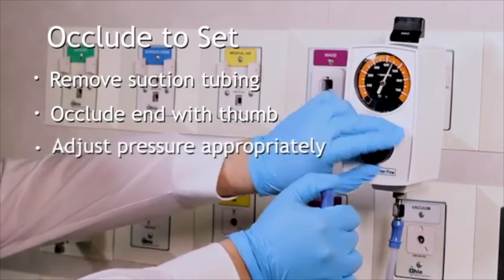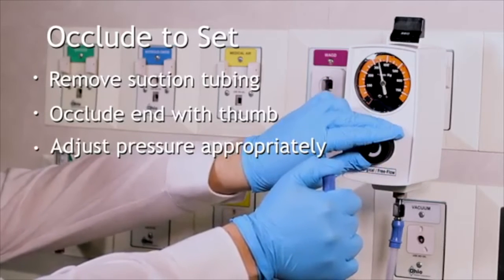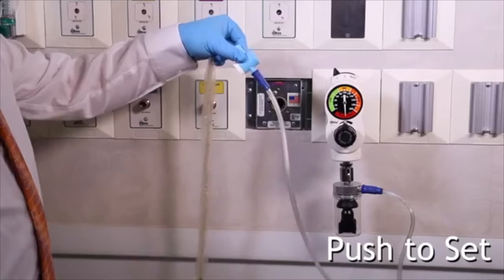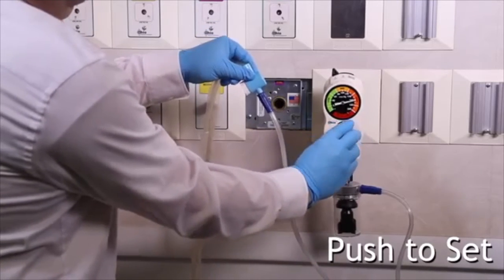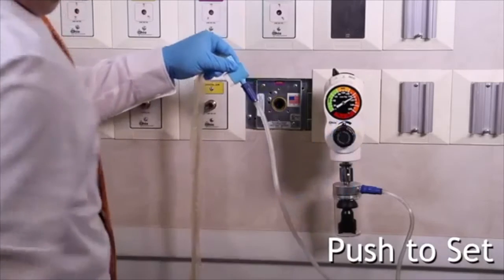Then adjust the suction pressure to less than negative 150 millimeters of mercury in adults. The other method uses a special suction regulator called 'push to set,' where you press into the knob and turn it — after compressing it, it adjusts the pressure on its own, actually performing the occlusion process for you.